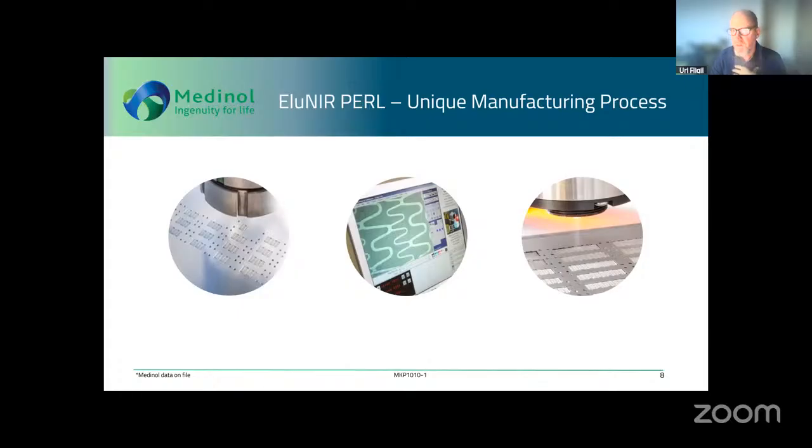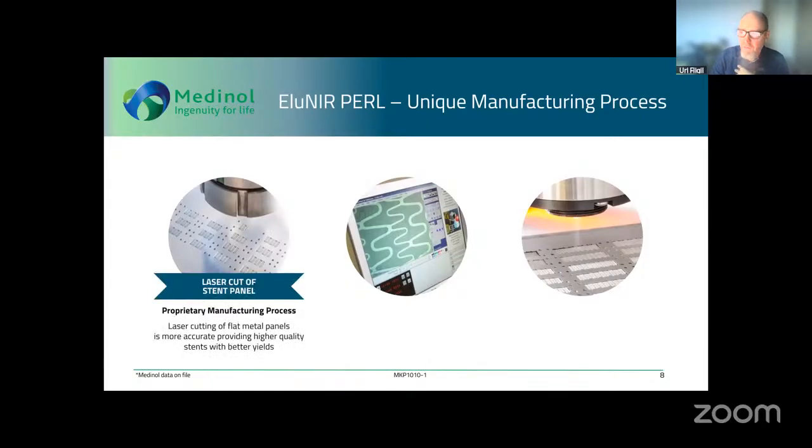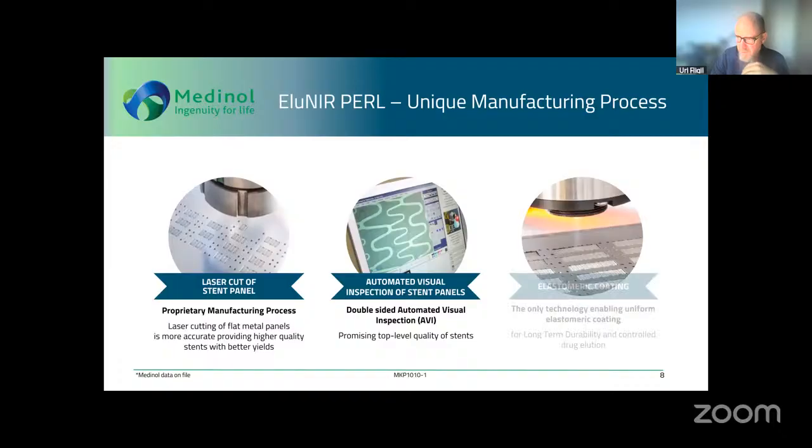In terms of our manufacturing, we have a unique manufacturing process. We are the only stent that is being produced on a flat panel. We use CNC devices; we can cut up to 500 stents on one flat panel. And then once the stents are cut, we have automated big chunks of our manufacturing process, such as the automated visual inspection of the stent panels.